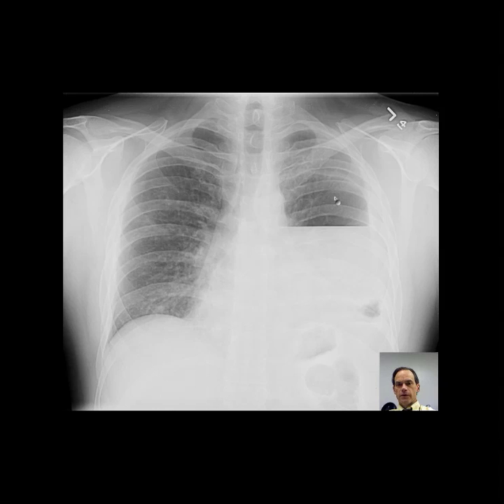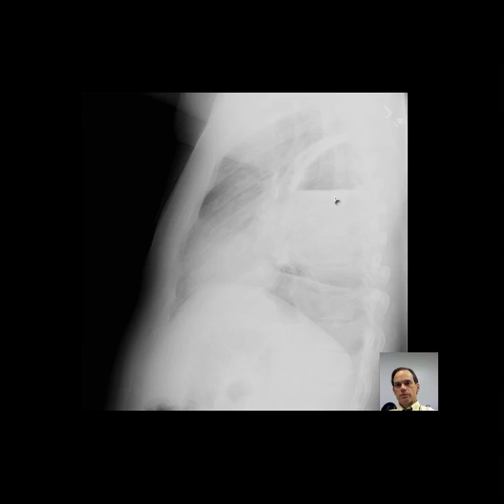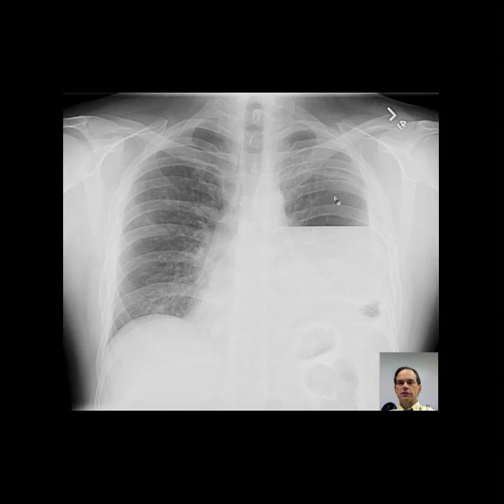This could well be related to a chronic empyema or abscess in the left pleural space posteriorly. The possibility of an intrapulmonary abscess or other cavitary lesion with fluid cannot be entirely excluded. Chest CT correlation is recommended for further evaluation.